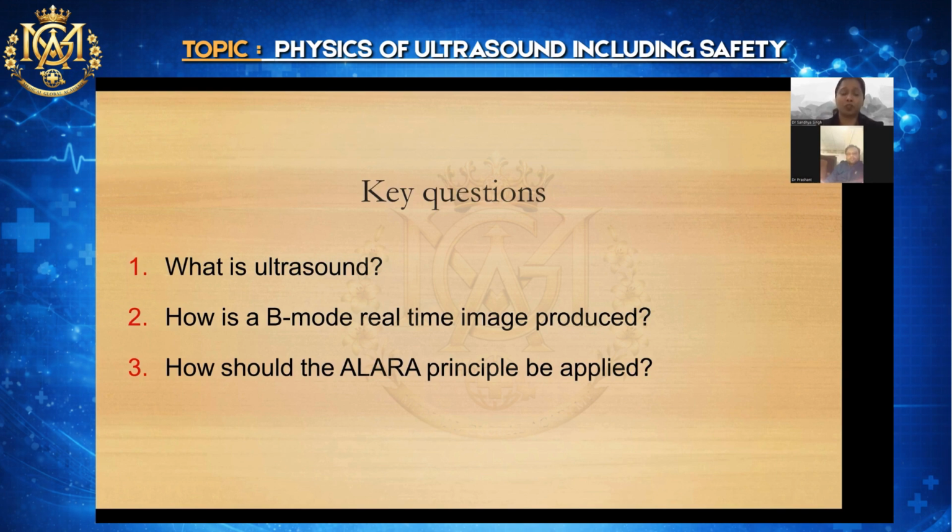And lastly, in today's lecture, you have to understand what the ALARA principle is. ALARA is as low as reasonably achievable.